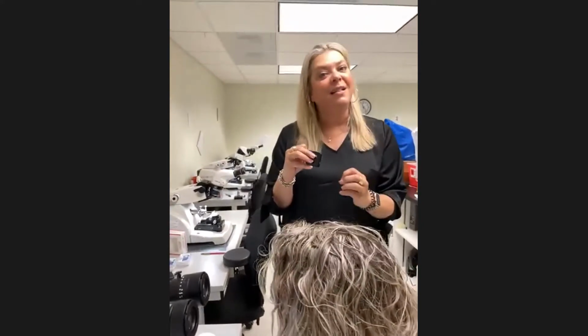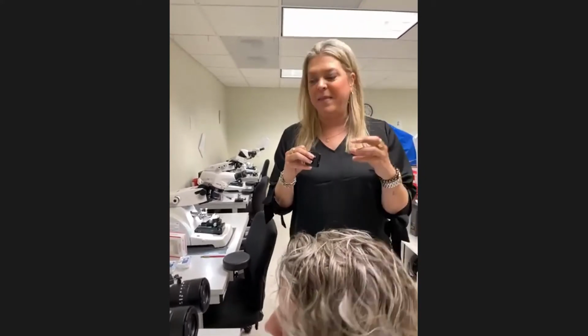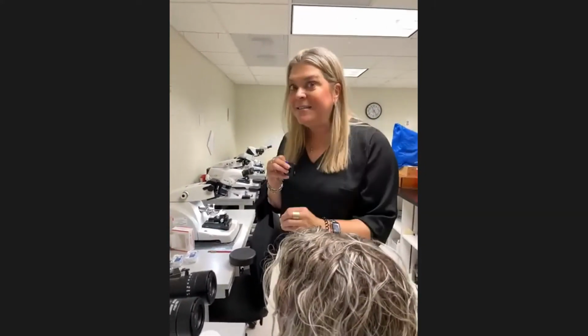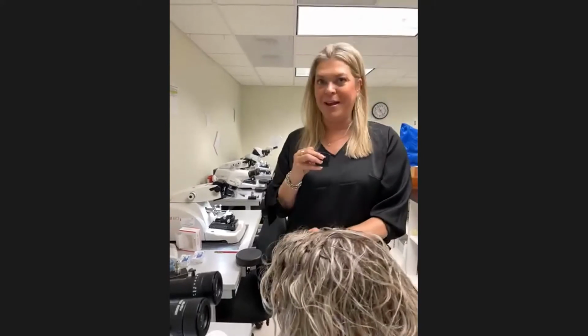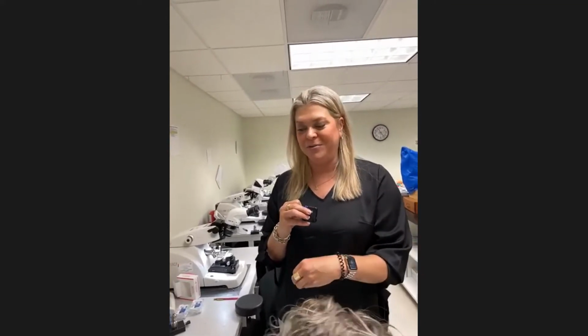So they have to find that glomerulus that is intact and whole, and then place it in the center of one of the squares on that grid. Like I said, that tiny copper grid has 100 squares inside, and they have to get it right in the middle of one of those. Then that grid is what we'll put into our electron microscope in order to examine the tissue at this level. So thank you, Brianna. Appreciate you.